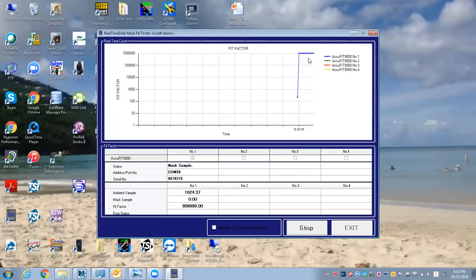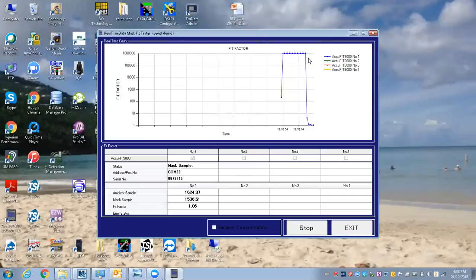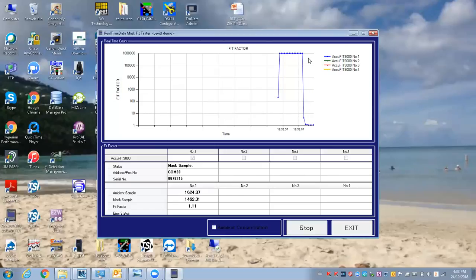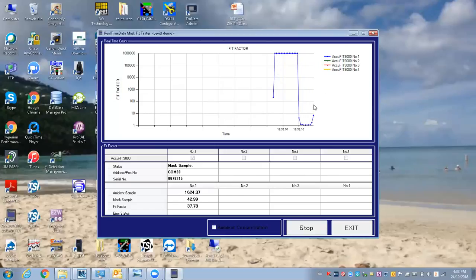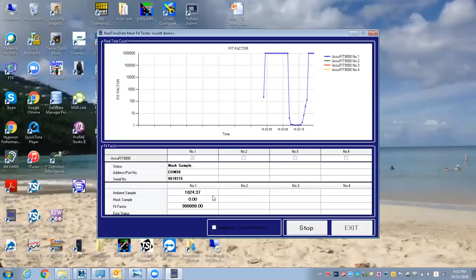You can see we have a very high fit factor. If I pull off the HEPA filter, or basically simulate a leak in the mask, you'd see how it very quickly drops. As you're adjusting the respirator on someone's face, you want that line on the graph to be going up as the fit gets better. I just put the filter back on and you can see it's very quick, giving me the real-time reading right here.